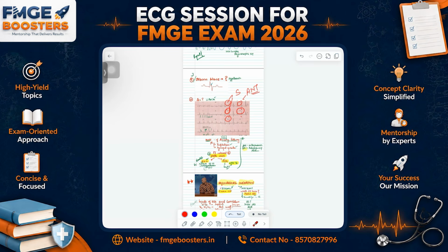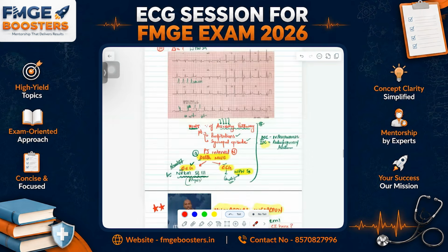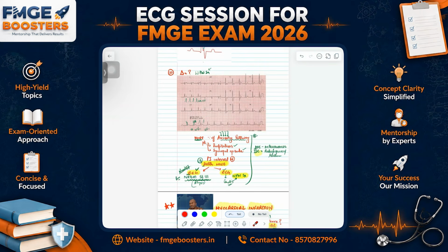And V5, V6 is what? Lateral. Just remember heart जो सबसे lateral में है, that is V5, V6. ठीक है? बाकी सारे you can remember as anterior one. And we talked about anterior, septal and lateral. क्या बचा? Inferior border, right? Inferior border will be 2, 3 and AVF.